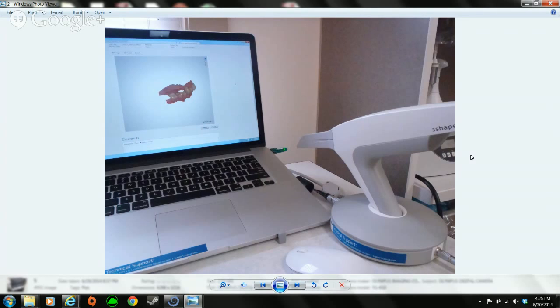Okay, I'm curious. What's the turnaround time from the time that you decide that a patient needs a surgical guide until the surgical guide's actually ready? It takes me about 10 minutes to plan an implant and design the surgical guide. The 3D printer on a single guide, if you're running one by itself in a pinch, my printer will print one of these small quadrant ones in about 2.5 hours.